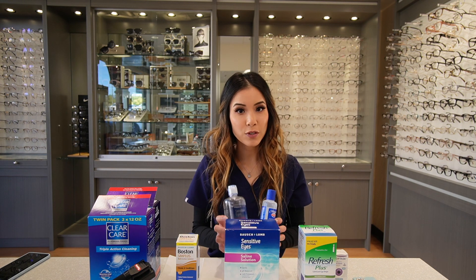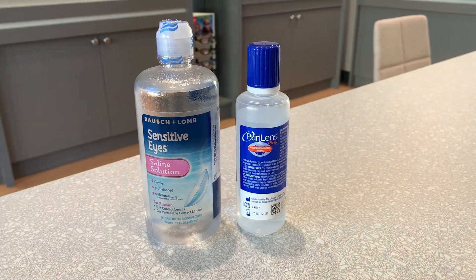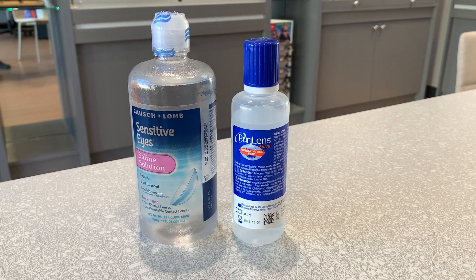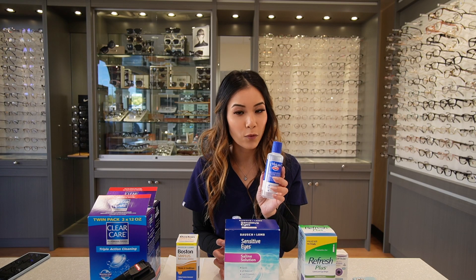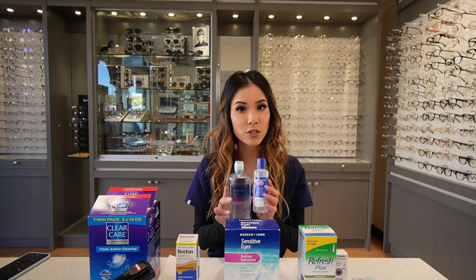The third product is Saline Solution. Here we have two different brands: Boshalom and Pure Lens. Boshalom should be tossed after 90 days of use. Pure Lens should be tossed after 14 days. This is used to rinse out your lenses.